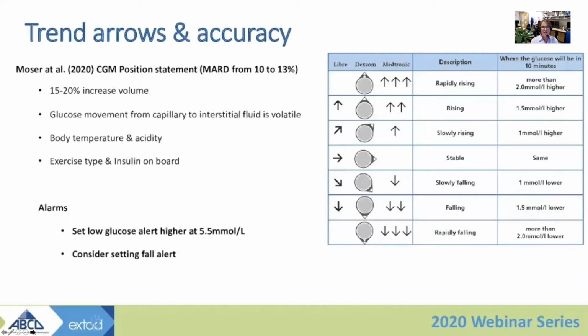Okay. A new way of thinking about exercise. Before the dawn of CGM and closed loop algorithms, we were obviously focusing a lot on carb replacement, getting extra carbs into your body before you exercise to buffer that effect of going low. But now we have the beauty of CGMs, and we can think a lot more dynamically about where my blood sugar is at the time, which will then influence what we do to help with that. So in some situations, you may need to have a few extra carbs to buffer that drop. Even with an ease off on, you may find that you need a little bit of extra carbohydrates, which we can drizzle in over the session rather than having it all in one go.